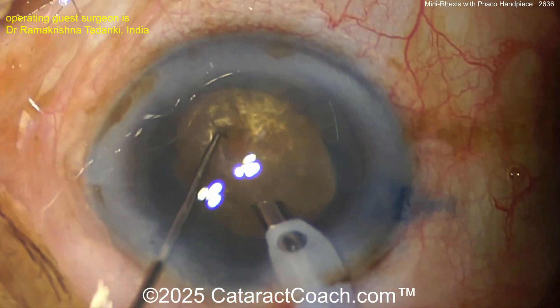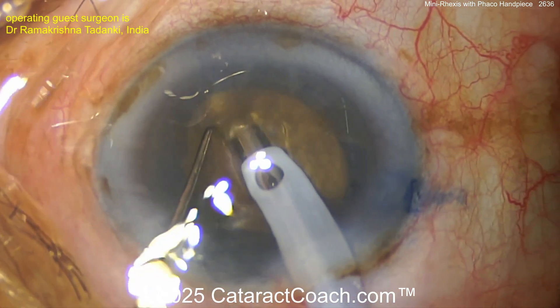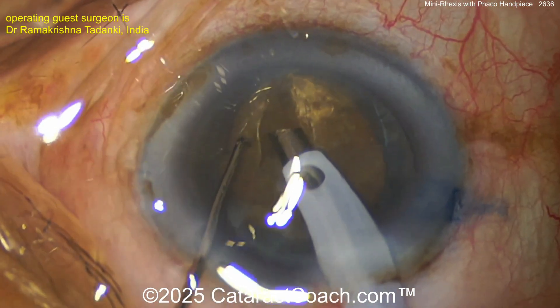A little bit of a groove down the middle. Now another groove — or maybe just creating a pit. You can bury the phaco probe; that's likely the technique. A little pit — or is it a full groove?